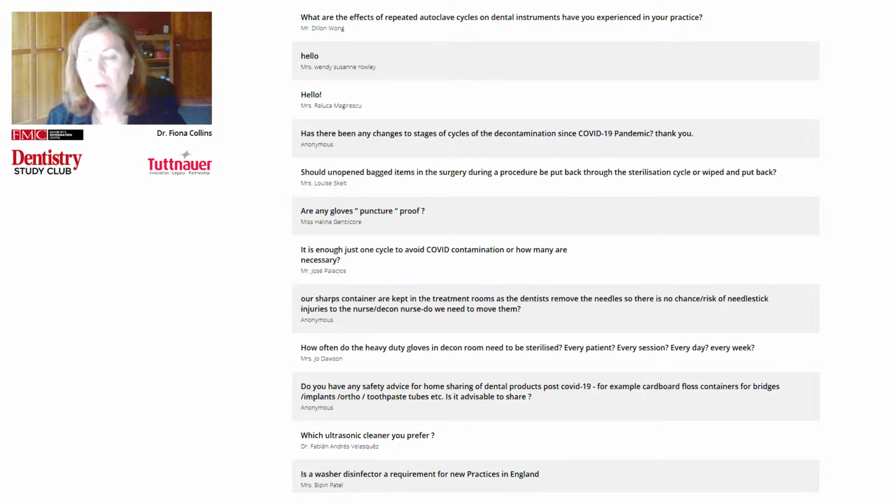There's a question on Class N autoclaves. In autoclaves in general, they have to test the cycles that are on the autoclave instructions for use. And the last question is, in some setups in Ghana, where it's difficult procuring fast handpieces in their numbers, sometimes a single handpiece is used for multiple patients. It's usually wrapped in cling film and disinfected between patients. It's not ideal practice. What advice do you give us to improve our infection prevention control measures?